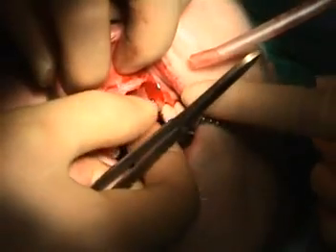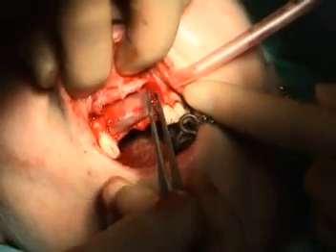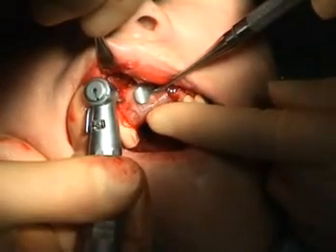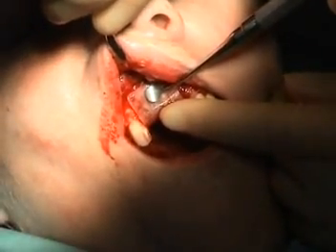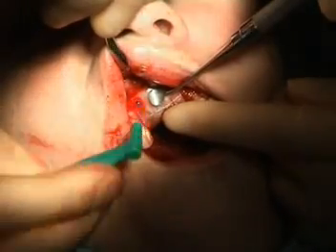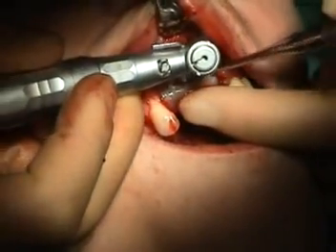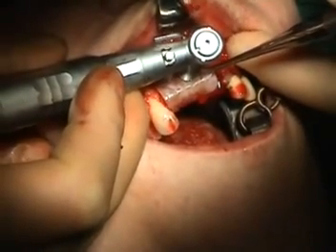The prepared and carefully shaped membrane can now be placed in position. A hole is now drilled through the membrane into the bone, and while keeping the membrane in position, the loaded tack applicator is then pressed firmly into the hole. Further tacks can then be placed as needed until the membrane is firmly stabilized.